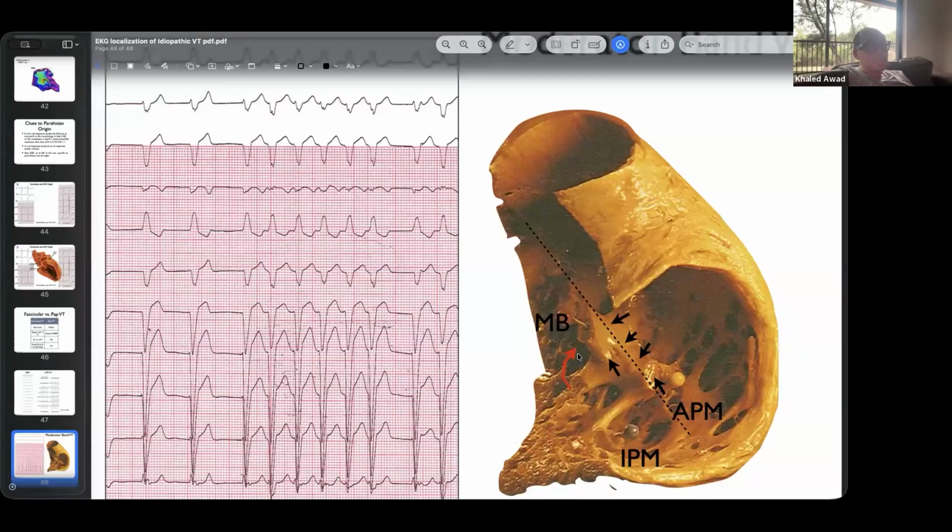These are mistakes that sometimes are made and they create problems. I'm not going to deliver a lesion for 2 minutes if my opening impedance is 80 ohms. That's wrong. You shouldn't do that. You should not put too many grounding patches, or put them too close to the heart. You're going to have a very low impedance and you cannot deliver lesions for a long time. You'll get a steam pop right away. That takes away your ability to deliver long lesions.